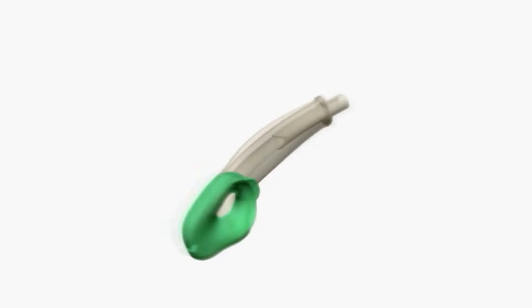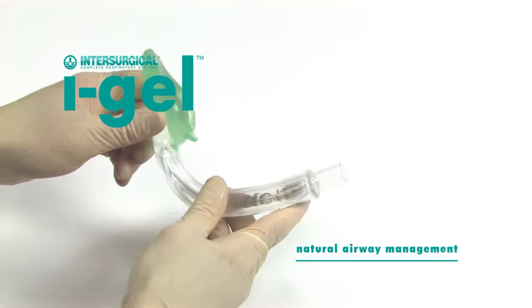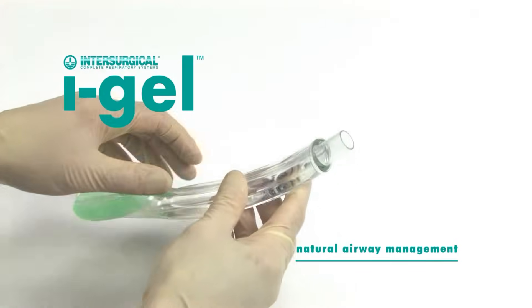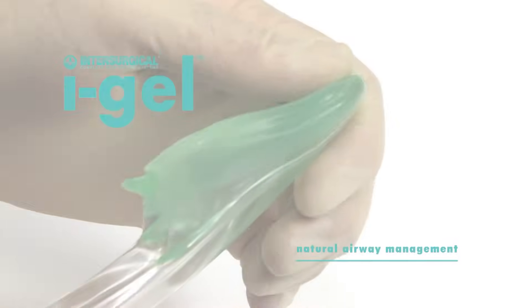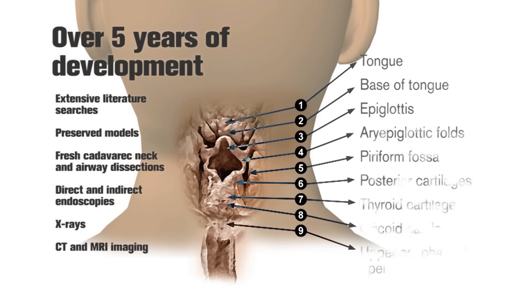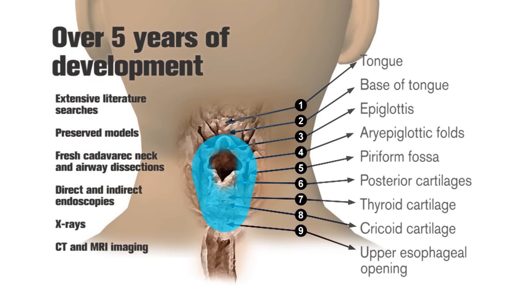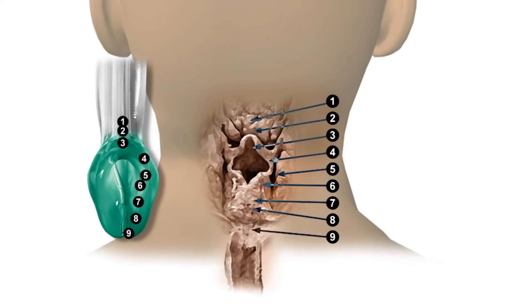The iGel is a novel and innovative supraglottic airway management device made of a medical-grade thermoplastic elastomer which is soft, gel-like and transparent. It took over five years of development to perfect a non-inflatable anatomical seal of the pharyngeal, laryngeal and perilaryngeal structures that would reduce compression trauma.